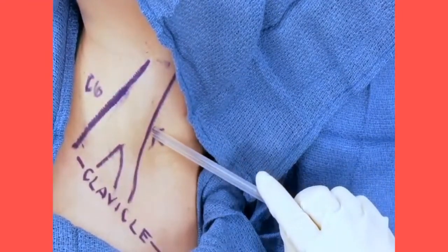This is the location for needle placement, posterior and angled slightly caudad, no more than 2.5 cm deep.